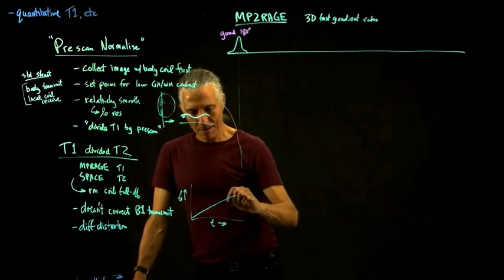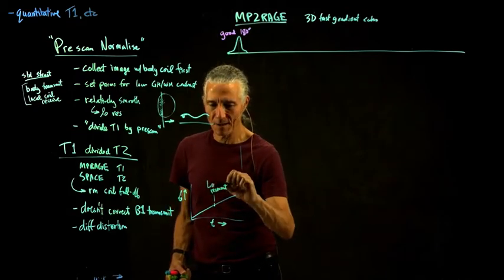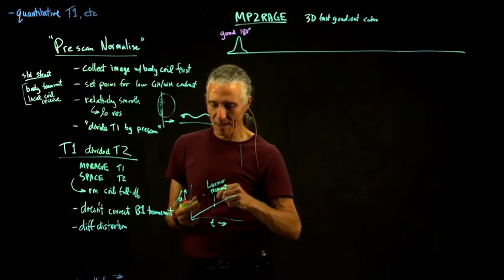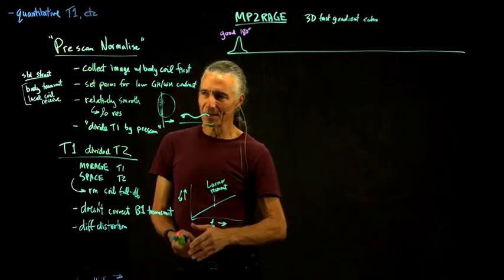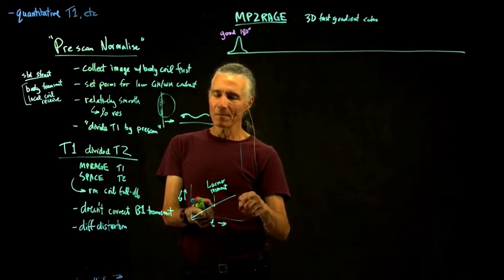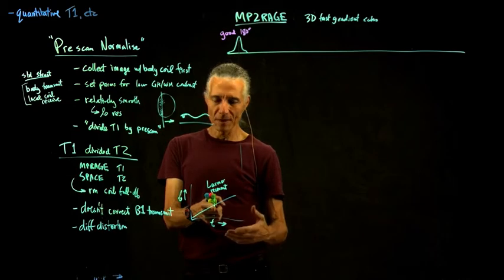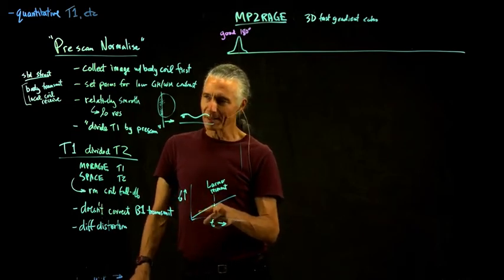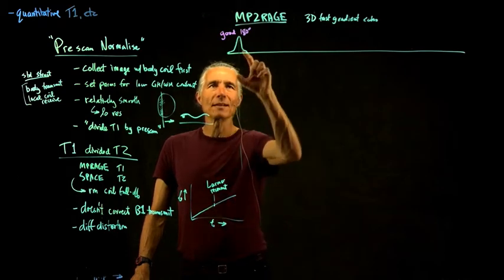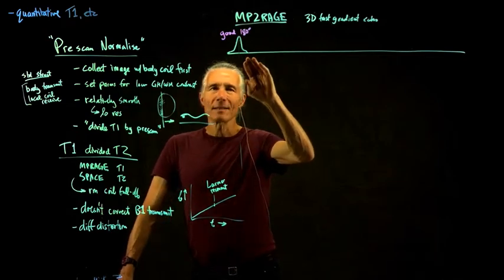And here is the resonant frequency, the Larmor frequency. So it's unbelievably simple. You just ramp up the frequency of the transmitter, going through the actual frequency, which is defined by whatever the B0 field is. And it turns out that, amazingly, and we'll talk about how that actually works, that will do an extremely good 180. The reason that it's not normally done is because it takes a long time.